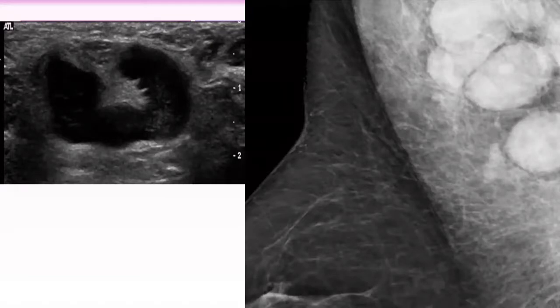On ultrasound, it demonstrates unequal increased cortical thickness, diffuse but unequal, and lobulated. Yes, it is lobulated, but still we could appreciate part of the compressed fatty hilum on ultrasound, which was not seen on mammography.